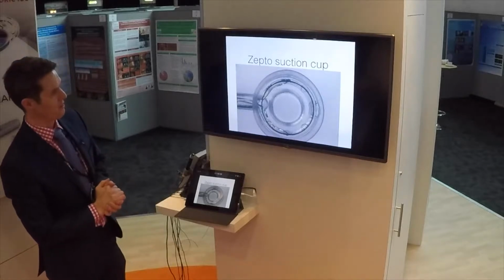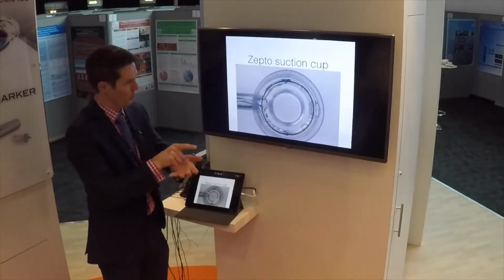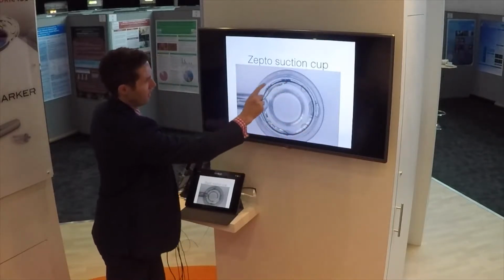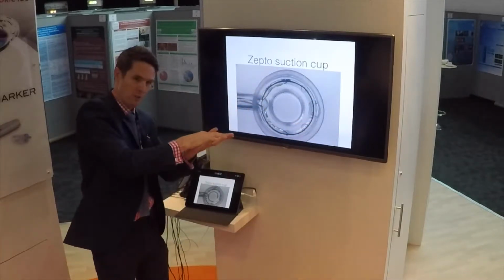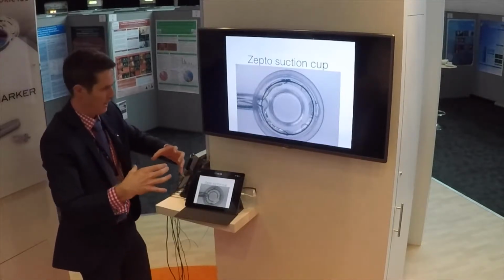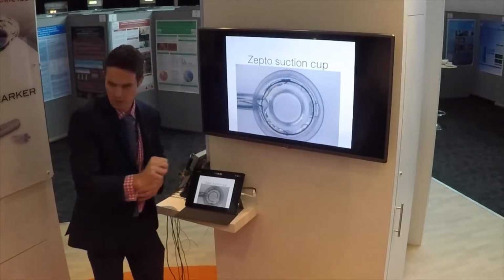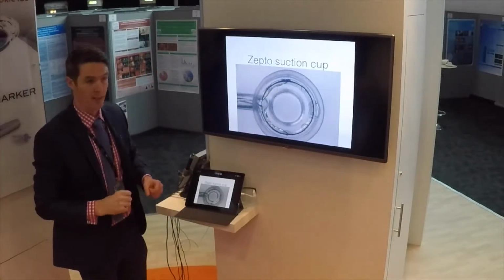This is the underside of the suction cup in magnification. So what you can see here is with the blue button pushed forward, this pushes these two gold levers forward, which then open up this nitinol, the nickel titanium alloy circle. This is the silicone suction cup, which applies onto the anterior capsule. And the suction, this is the opening here through which suction happens. So it attaches to the anterior capsule and creates a link between capsule and the silicone. This is, I think, 5.2 to 5.5 millimeters in diameter, so you get a consistent capsular access opening each surgery.